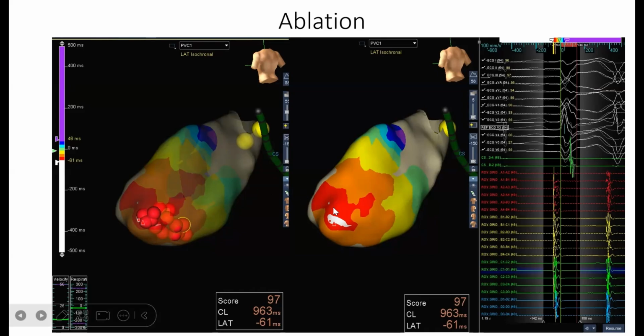So you should check both sides first before you ablate, and or correct your map. Maybe that's the wrong spot as well. Maybe they tagged the wrong area. But if your map is correct, then you're talking about deep tissue, two breakthrough sites, okay? There's a nice paper written by the Circulation Arrhythmia basic science group in 2022. It's a good paper to review this aspect of 3D mapping.